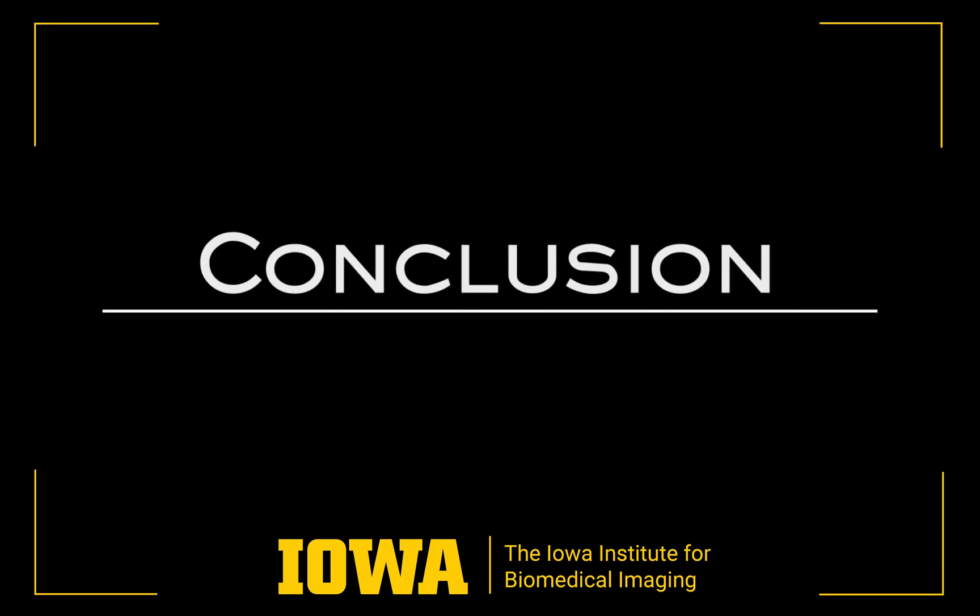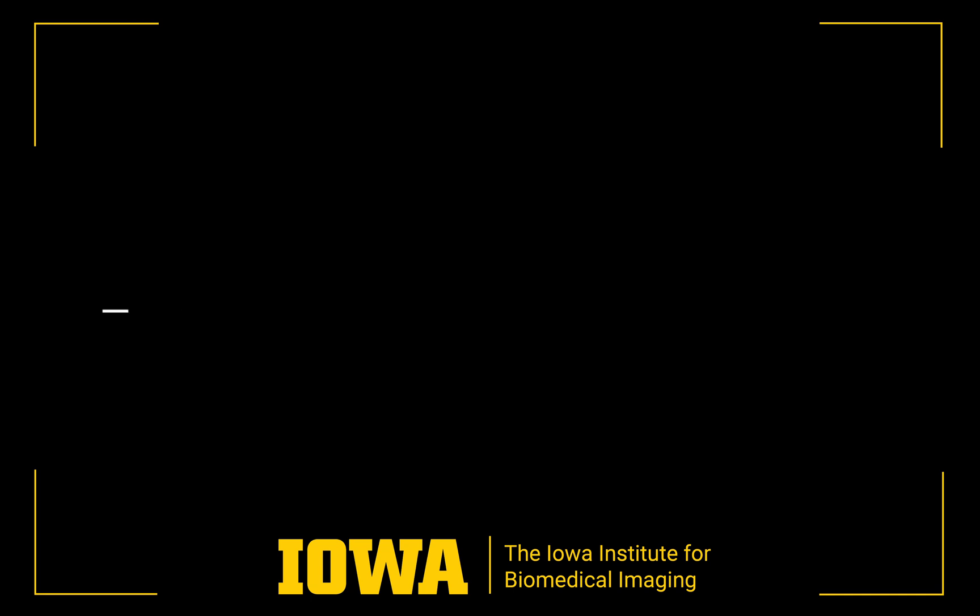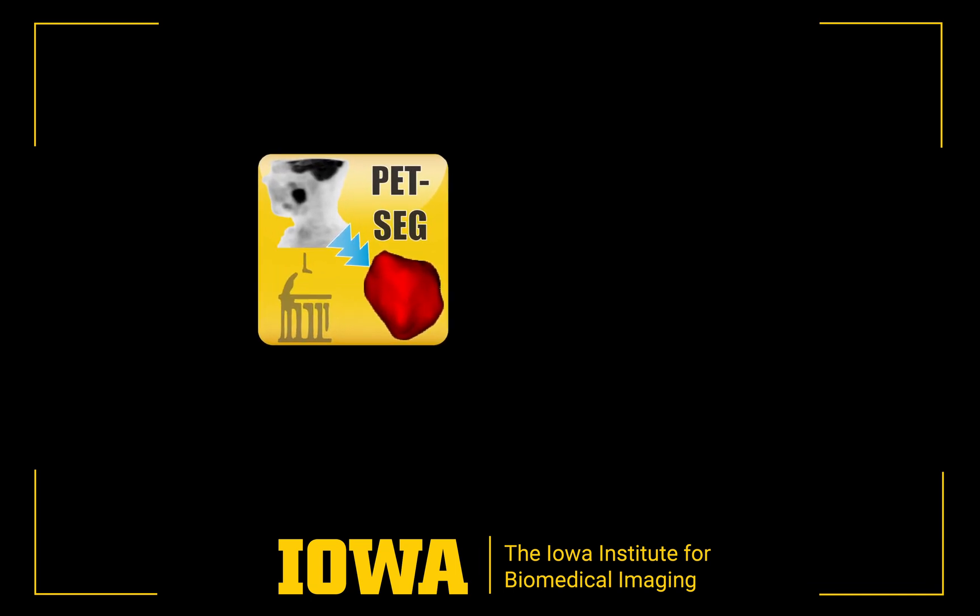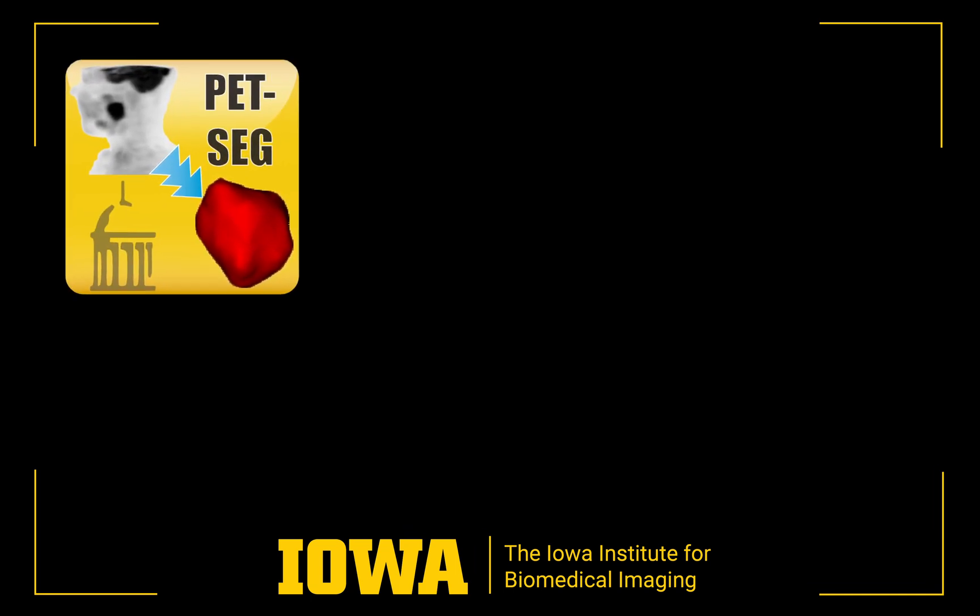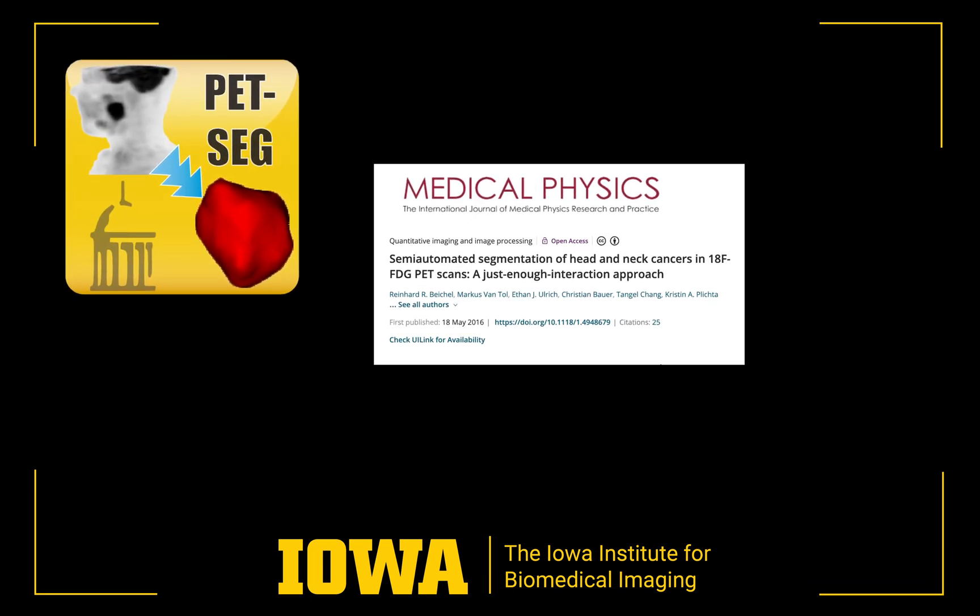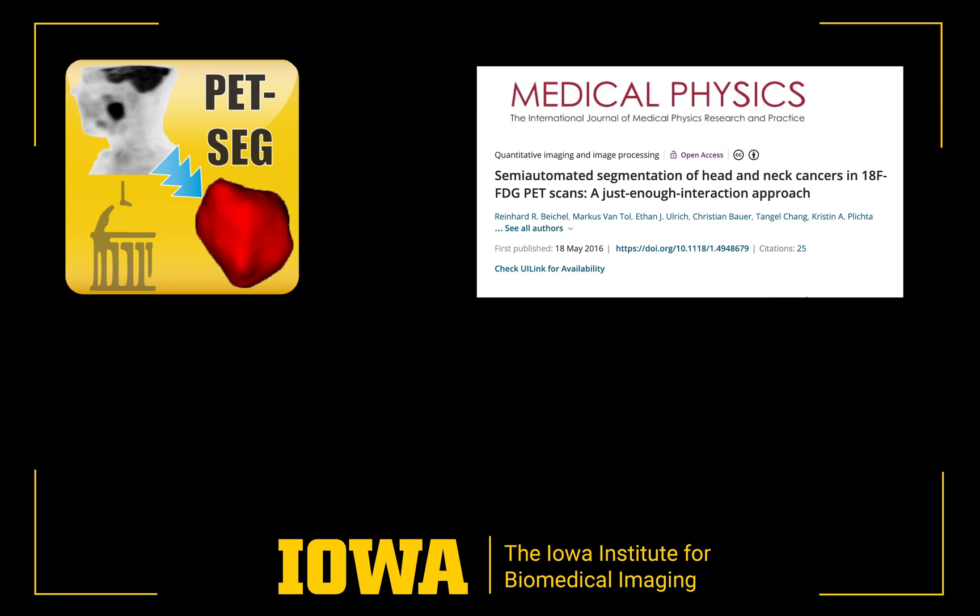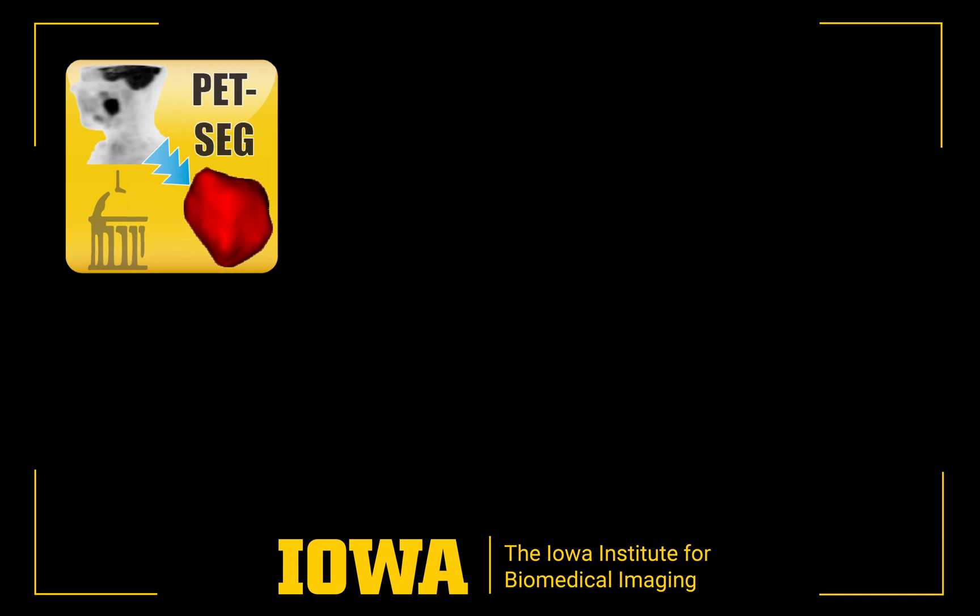This video introduced our PET tumor segmentation tool and its usage. The tool was designed based on a just enough interaction approach and provides high quality segmentations for most cases, with only one or a few clicks.